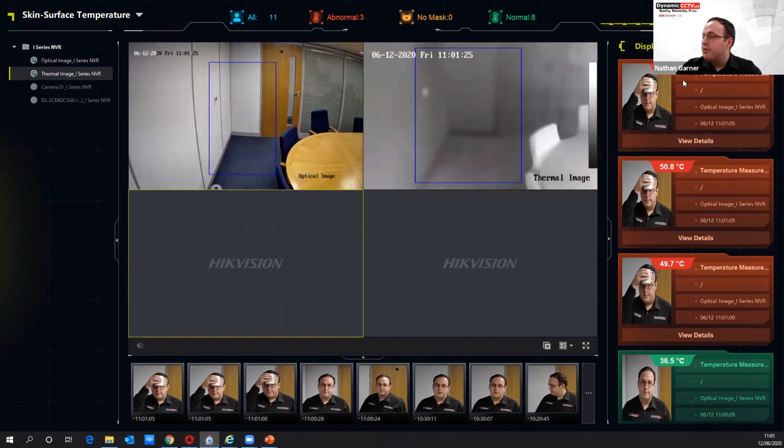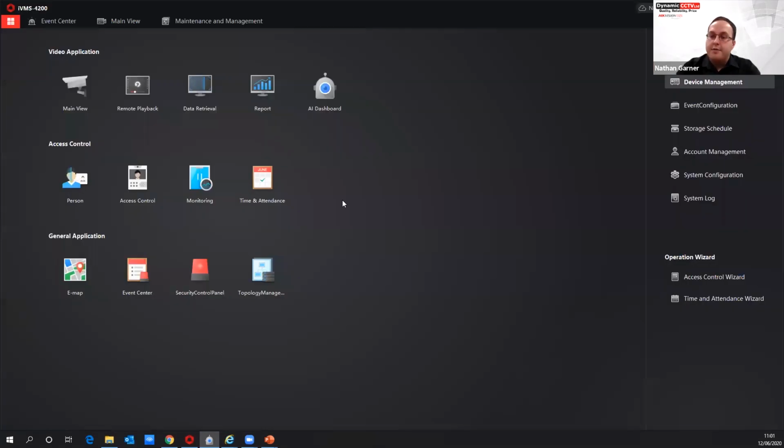It's now cooled down quite a bit. So that's a pretty useful feature to have the actual notifications come through to a PC, which can be for your operators or anything on site. There's also more advanced linkage actions using the CCTV platform for large systems or where you're needing it to alert through to multiple people as well.